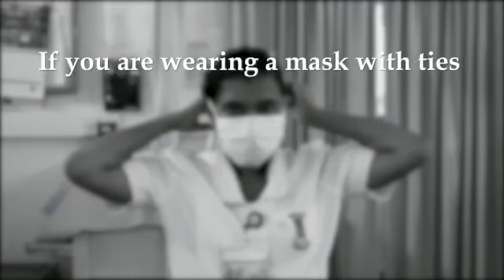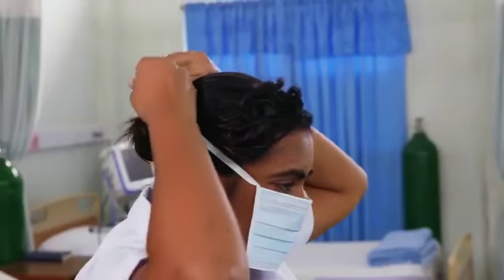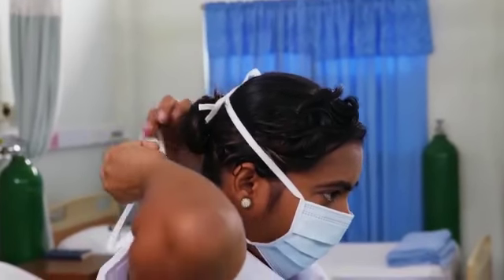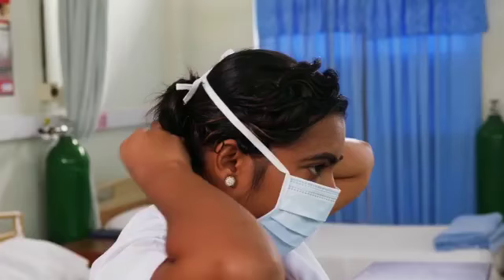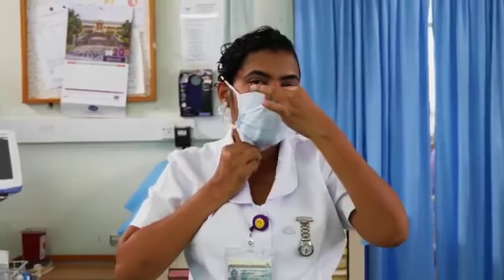If you're wearing a mask with ties, bring the mask to your nose level and place the ties over the crown of your head and secure with a bow. Then take the bottom ties, one in each hand, and secure with a bow at the nape of your neck. Pull the bottom of the mask over your mouth and chin.